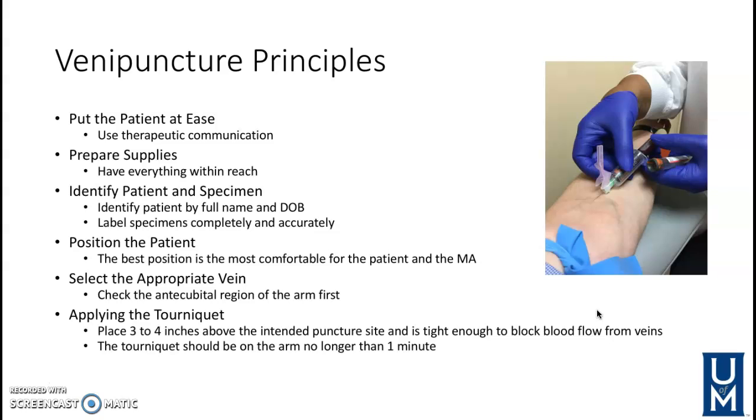So some principles for venipuncture, and these are also addressed in the videos that I've created for our skills, but I just want to reiterate some of the points here. Number one, the very first step we always do for venipuncture is put the patient at ease. They're often going to be anxious, they're going to be scared, they're not going to want to get their blood drawn, so the first thing we always do is put the patient at ease.